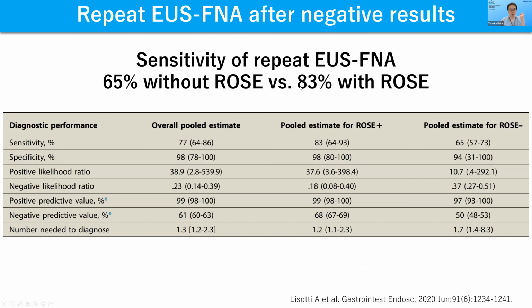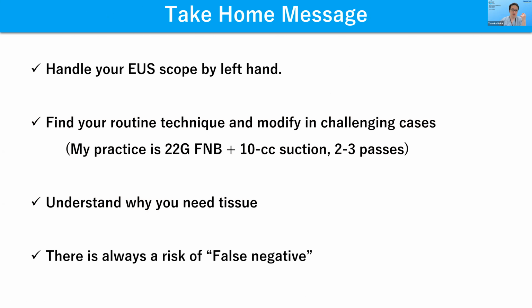And if it's negative in the first session, you should choose ROSE, rapid on-site evaluation, because in the second session, if you evaluate with ROSE, the sensitivity gets higher. So in those special situations, you should consider asking the pathologist to evaluate during the procedure. This is my last slide. I think this is the most important part for the beginners.